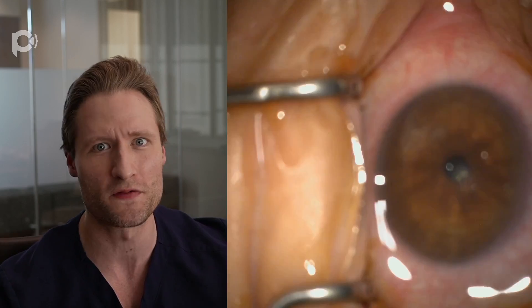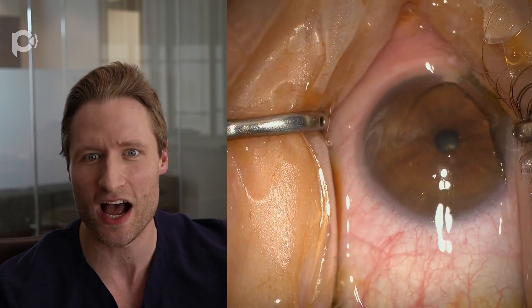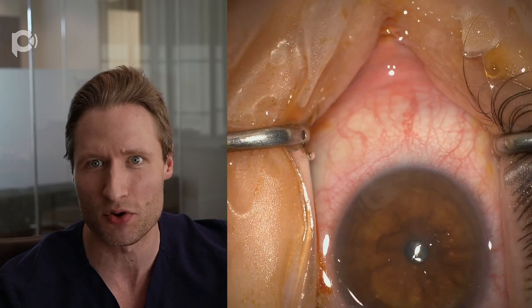The other thing that might discourage people from picking up CARES is the perception that you need a femtosecond laser to do the operation, but that's not true. You neither need a femtosecond laser, nor do you need to use these gummy segments and make multiple incisions to shimmy them into the eye. This is a CARES operation that I did in our office probably an hour ago, and I want to show you the full five-minute length of the surgery to show you exactly how easy and simple this operation can be.